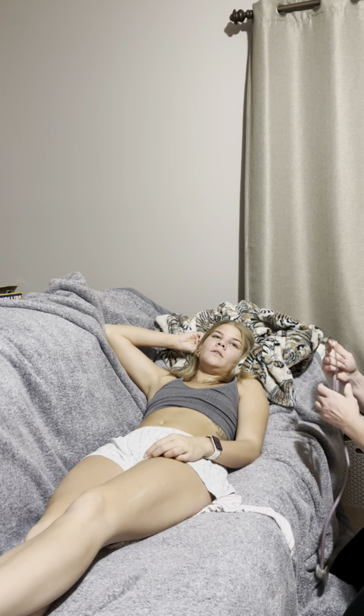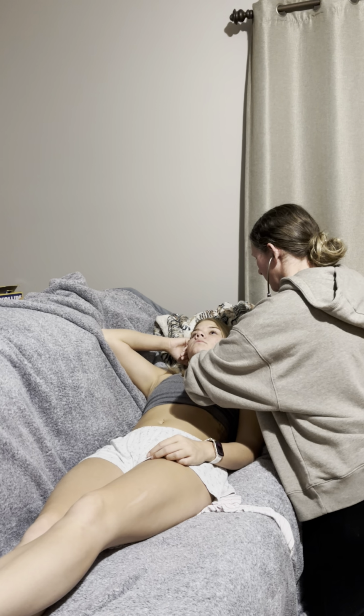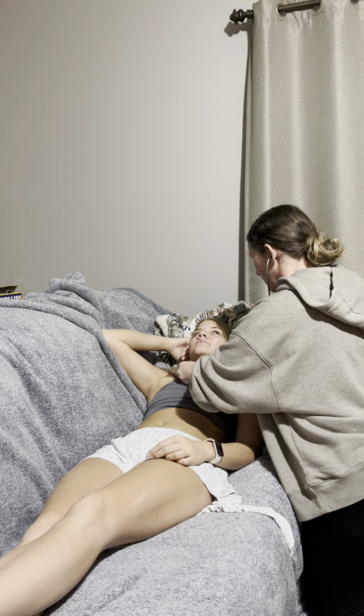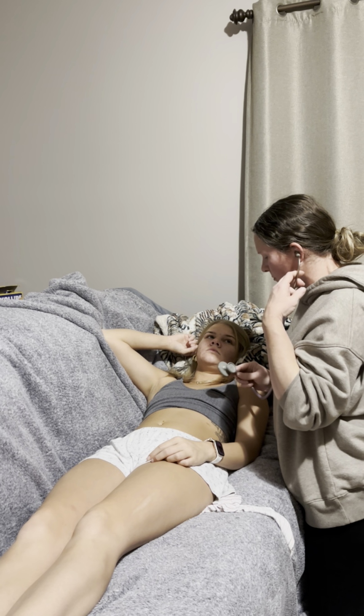So I'm going to go ahead and use the bell to auscultate the carotids for bruits. If you could exhale and then hold your breath. Exhale. And then hold. Okay. And then exhale. And hold. Perfect.